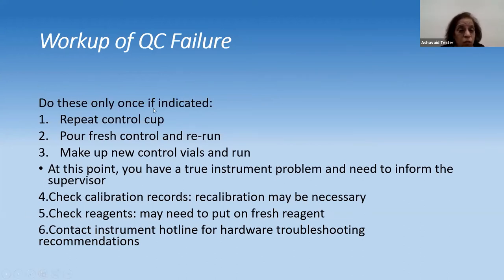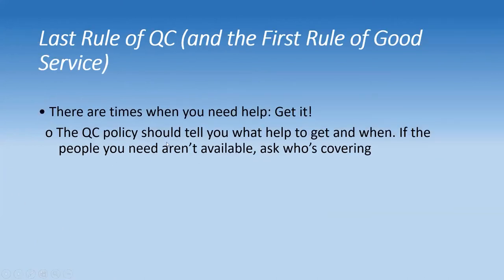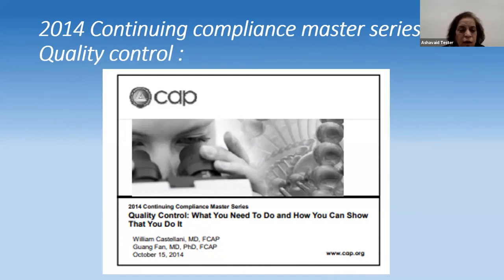For a major QC failure: first repeat the control, then prepare fresh control vials and rerun. If that hasn't rectified it, it is an instrument problem — check calibration records, recalibrate if necessary, put in fresh reagents. If all this fails, call the biomedical engineer for hardware troubleshooting. Your QC policy should tell you what help to get and when to get it, and there must be provisions for backup coverage.